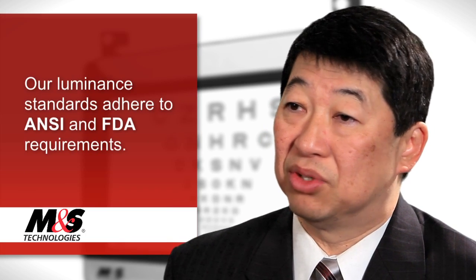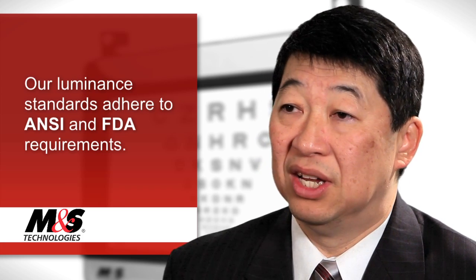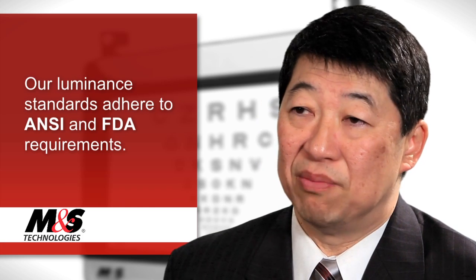Well, I think all ophthalmologists understand that the Snellen acuity chart works very well for, say, refractive error and for refracting our patients. But when we start dealing with pathology, and of course I deal primarily with cataracts, there are a lot of shortcomings to using high contrast Snellen letters. And so it's really perhaps a disservice that we do to some of our patients where they're reassured that they're still actually functioning quite well due to the traditional Snellen metric, when in fact they actually have a disability that would be improved by cataract surgery.